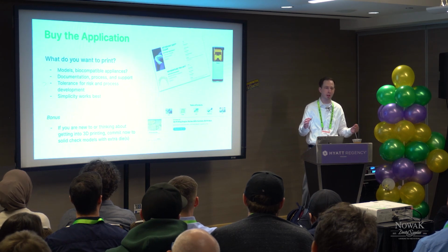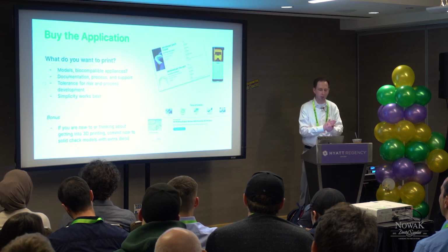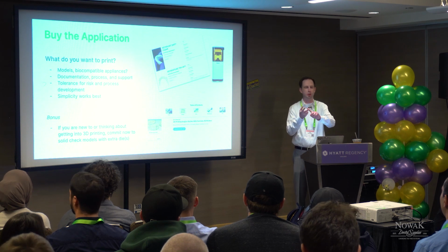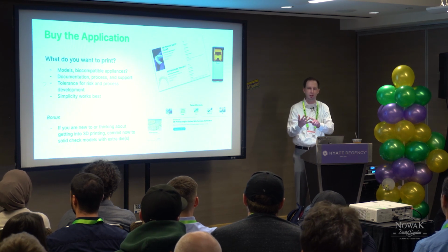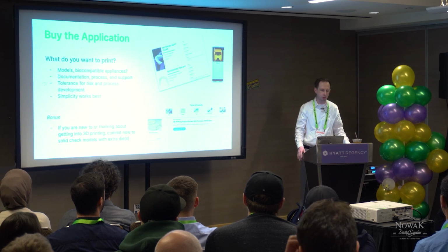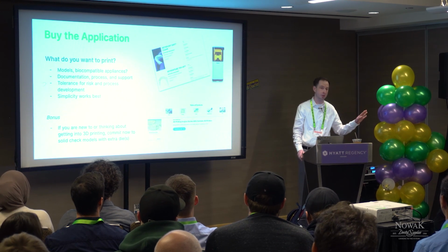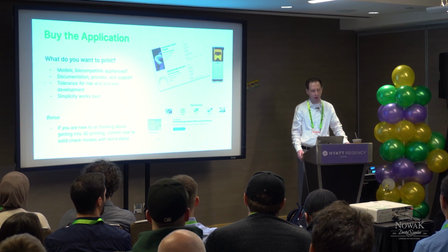And simplicity works best. You want a complete and concise process, but try to reduce it down. You don't want to come into this thinking, I'm going to do surgical guides, splints, hard, soft, I'm going to do denture teeth with milled teeth, and it's like, okay, slow the roll. I mean, you can build into it. It's certainly viable, but it's a lot to take in. We're not even talking about the CAD side. CAD is its own ball of wax at making that work.